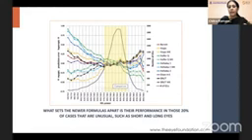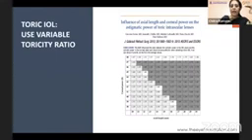And towards this, the average formulas work well in most of these normal eyes, but it is these newer formulas which seem to perform well in these extremes of axial length. The other thing which we need to look at is the toricity ratio. An average toricity ratio of 1.45 seems to do well for most of the toric IOL implants. But if it is an eye which has a short anterior chamber depth or a larger anterior chamber depth, the effective lens position assumptions are definitely challenged.